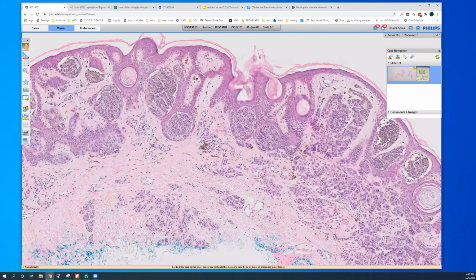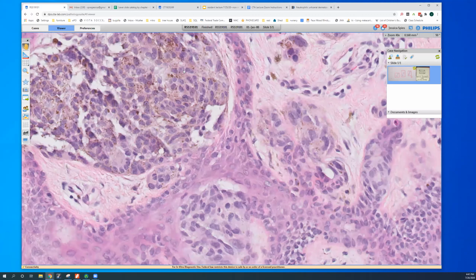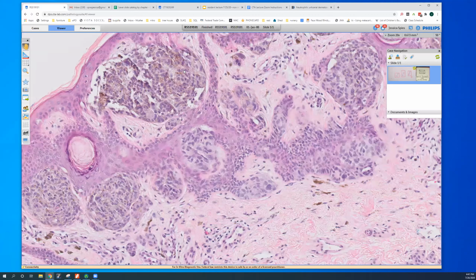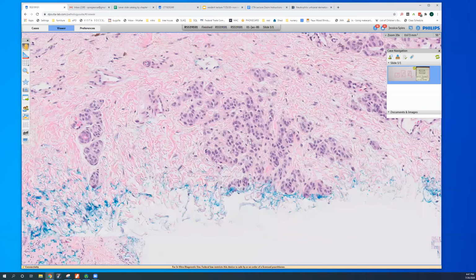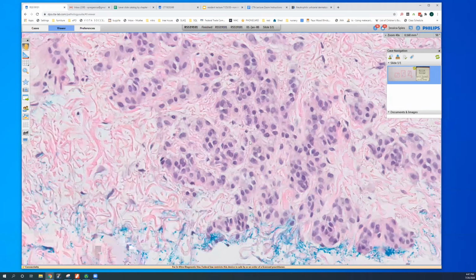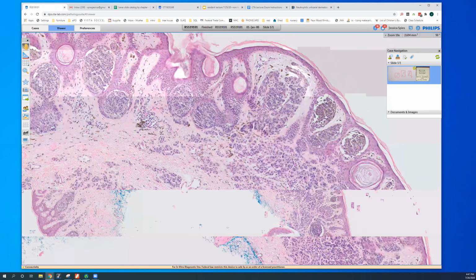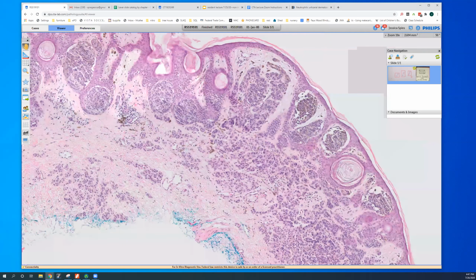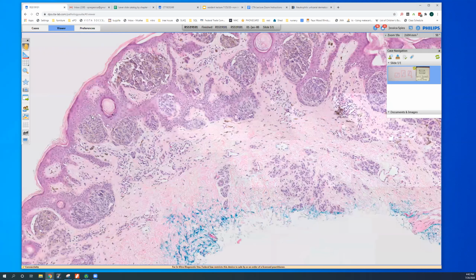Okay, so axilla of a young person. Look a little closer here. It's melanocytic, I think everybody can agree. Anybody? No one wants to commit themselves. Okay, I was told at UCSF, nobody gets to answer until everyone's typed in their guess.